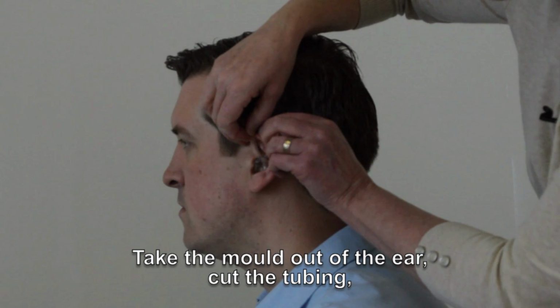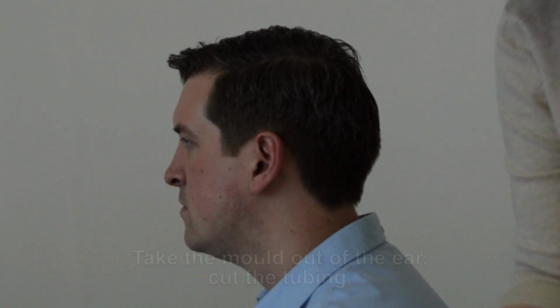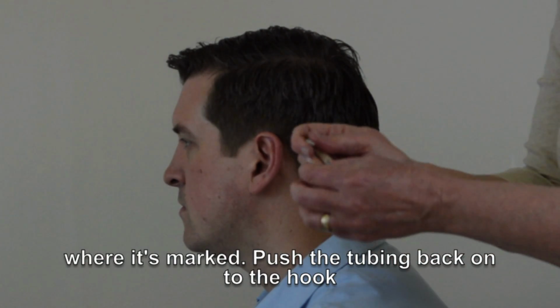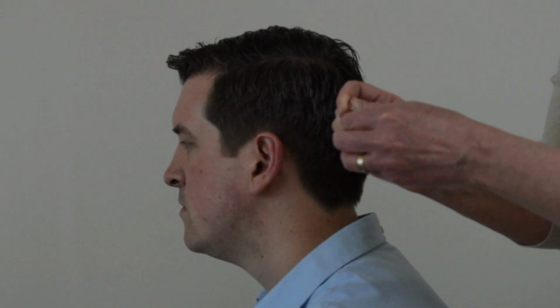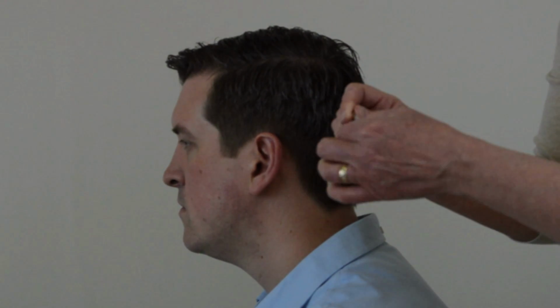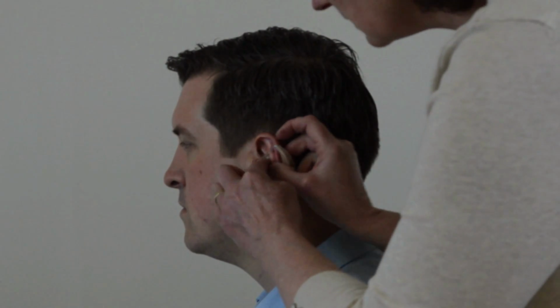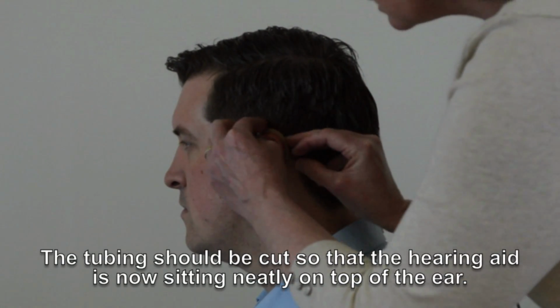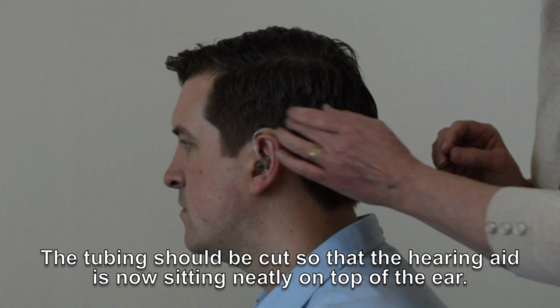Take the hearing aid and the ear mould out of the ear and just cut the tubing where it's marked. Push the ear mould onto the hook of the hearing aid, and the tubing should be cut so the hearing aid is sitting nice and neatly on top of the ear.